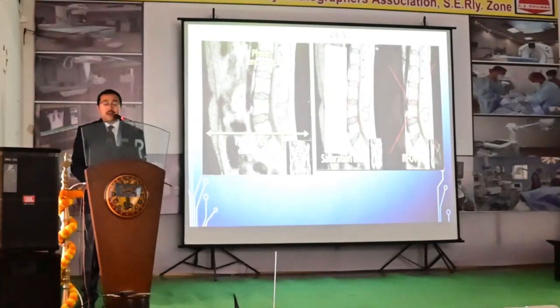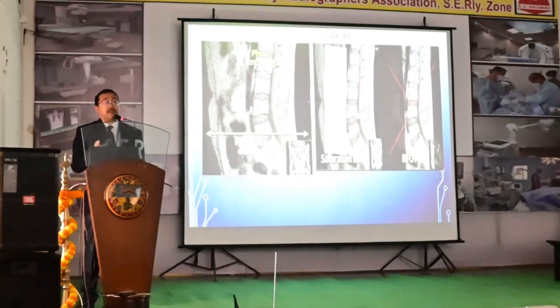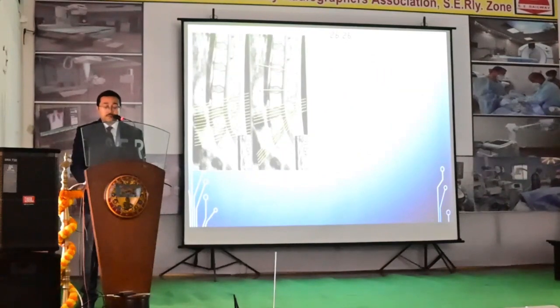So saturation band should not be used nowadays. Previously, the saturation band was used to nullify the findings of the prevertebral space. We are more concerned about the vertebra, but it should not be used because the paravertebral area is very important. You have to see the retroperitoneal structures, some problem with the aorta and its surrounding area. There may be some pathology. So saturation band also should not be used.